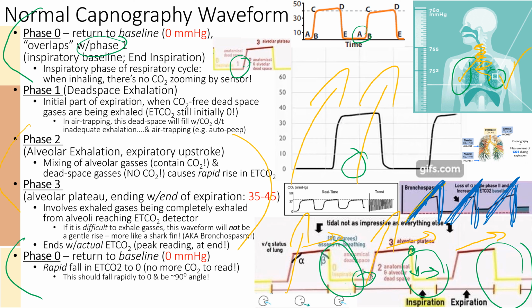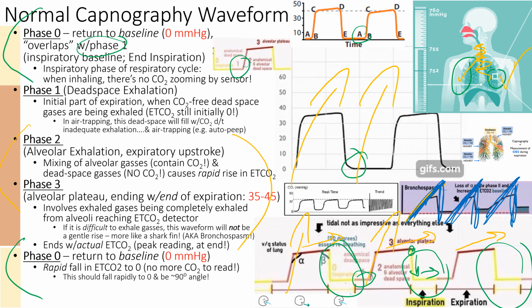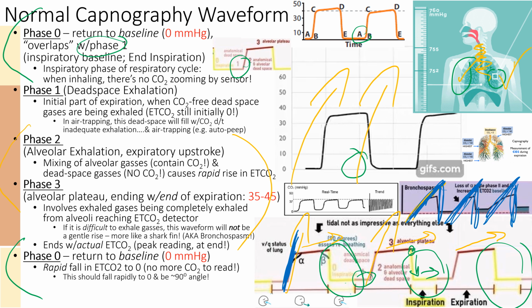And they could be anxious and squirming on the ventilator. Like, what's wrong? You're fine. You're in the ICU. It's Friday, right? You're good, all right? But then you realize the end-tidal CO2 has a shark fin appearance, oh, let me get your breathing treatment, right? Because they have difficulty getting that air out of the lungs. Instead of it being nice and upright, it's starting to trend down, okay?